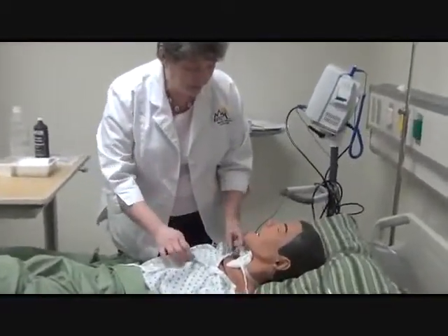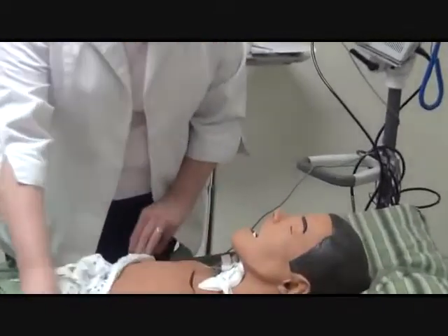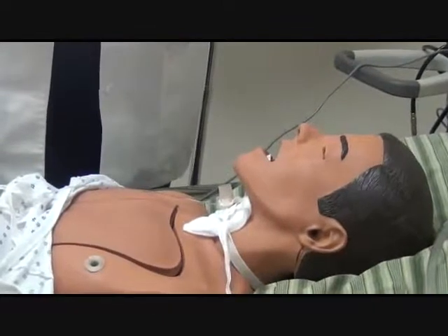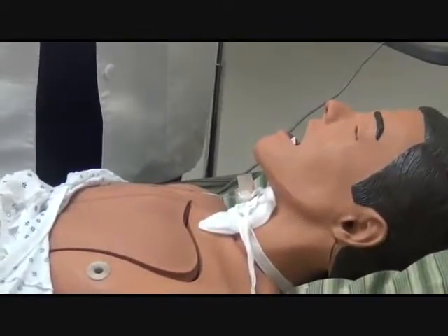This particular patient has a trach that has an inner cannula. There's two different types of trachs. There's non-fenestrated and fenestrated.